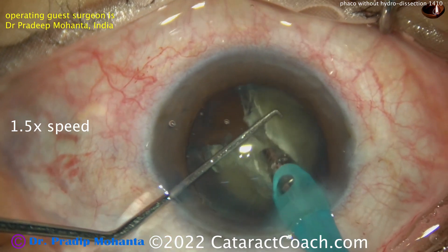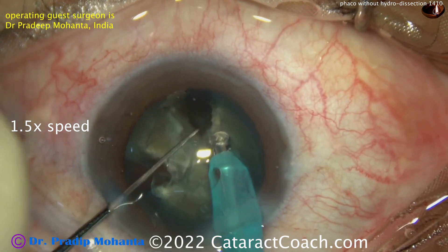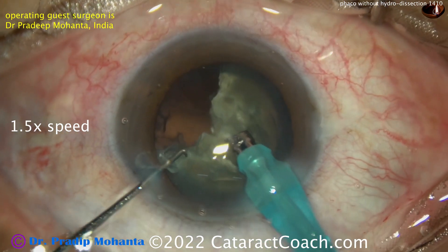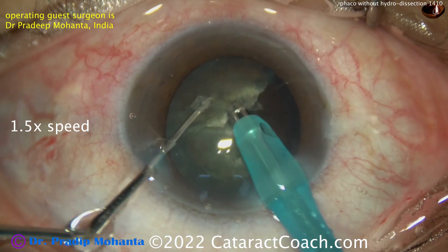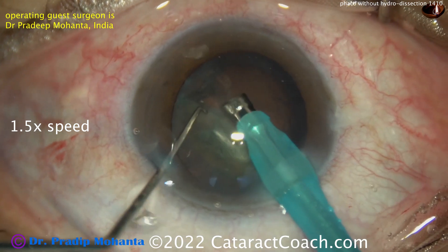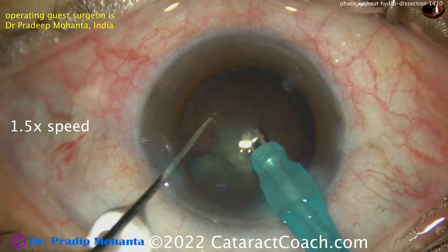Without rotating the nucleus, the Sinsky hook or chopper is introduced into the nuclear half and it can be chopped into smaller pieces. You've effectively removed about half the nucleus just by chopping it. The remaining hemi-nucleus is actually already split into two pieces, which can now be dialed around because there's more room, and brought above the capsular bag. It does tend to rotate now because the infusion going inside the eye has loosened it from the lens capsule.